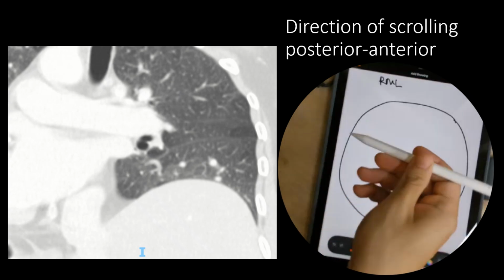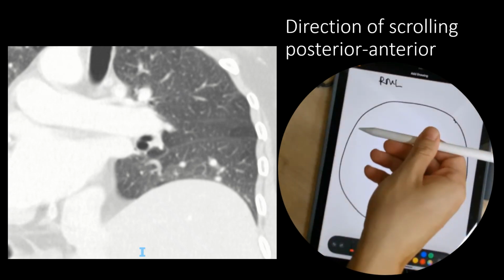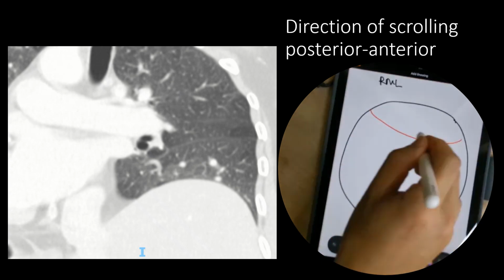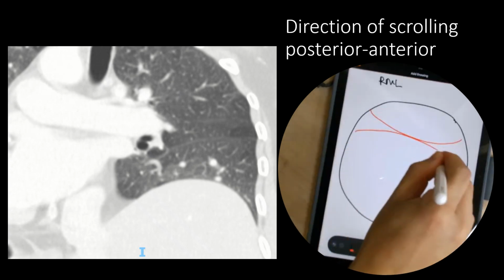We see the first branching occurs at an angle like so, and the top hole is smaller than the bottom one, and we should pay attention to draw it as such.